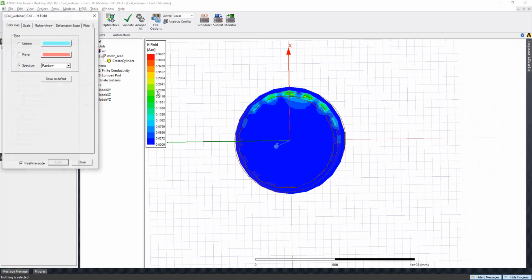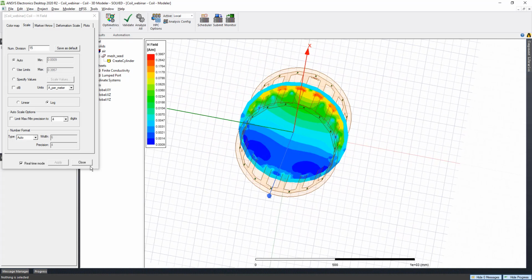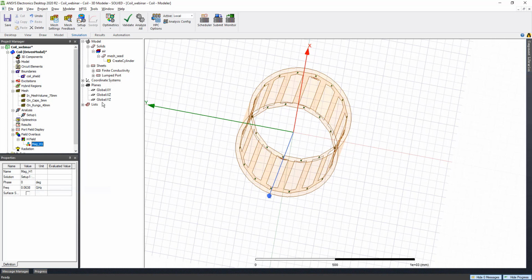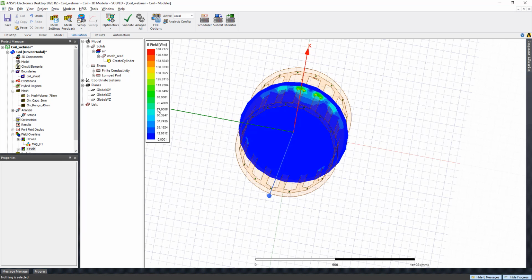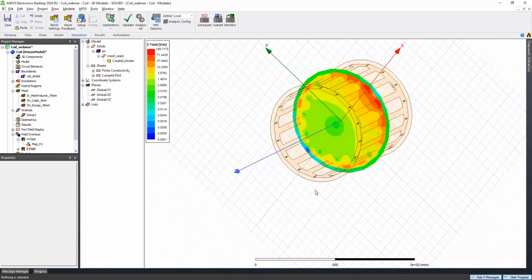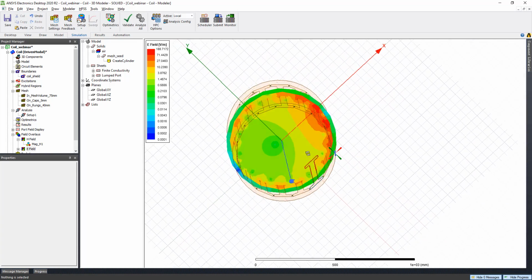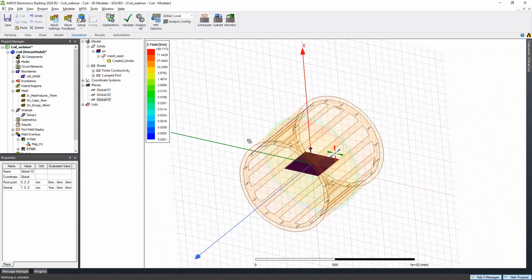Okay, so I have scaled it to be log scale. So we can look at some magnetic field. And same thing, we can go ahead and look at some electric field. Right, so log scale. In this case we don't have a uniform field because we are not adding the tuning capacitors to it yet. But once we add the tuning capacitors, then we can see the field.